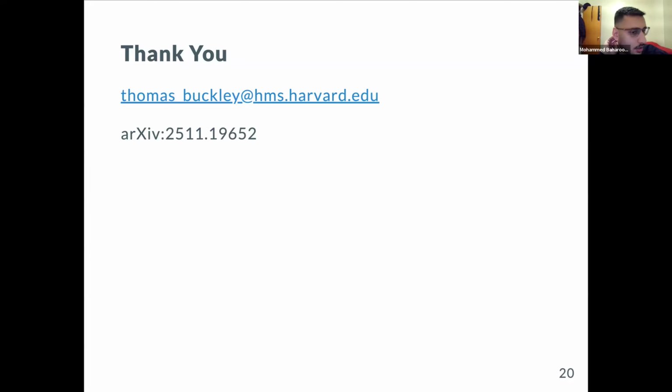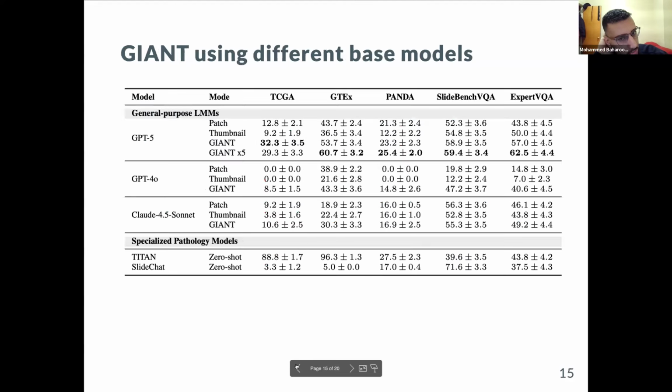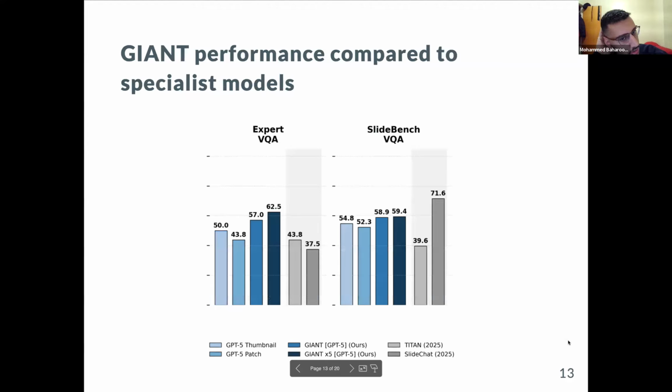Yeah, that makes sense. And then on slide 13, how different is the expert VQA dataset versus SlideBench? Like, what are some questions that are in expert VQA but not in SlideBench? And is SlideBench also made by pathologists? Yeah, that's a good question. SlideBench was the one created using TCGA reports and then having an LLM generate multiple choice questions from it. So there was no pathologist involvement in SlideBench VQA.